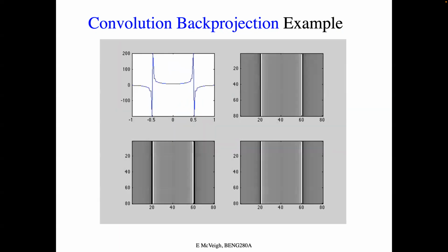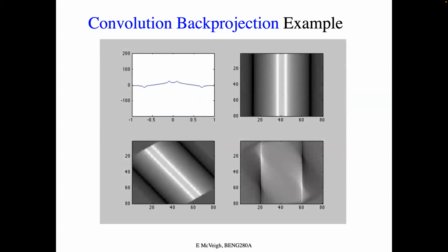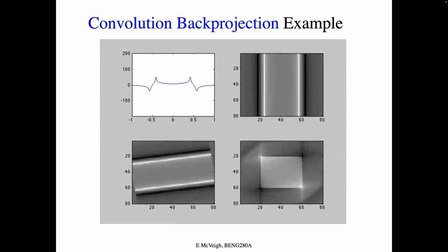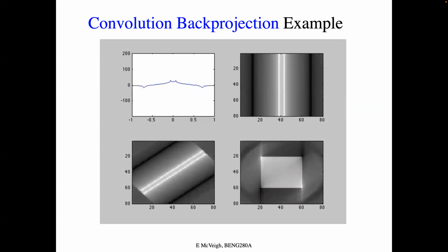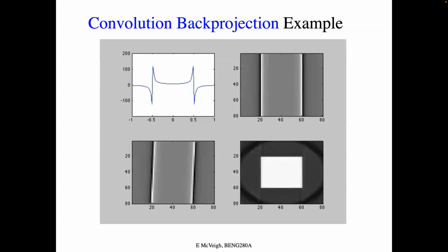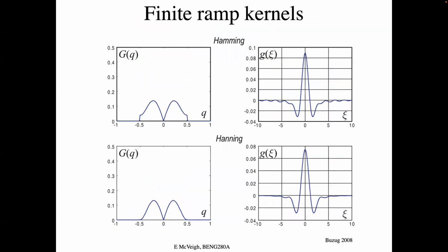And then when you do that convolution before you back project the data, this is what the data looks like here. So it's more complex, but as you can see, it will essentially add up when it's all done to the actual object. And so the edges have high fidelity. So we've looked at that.